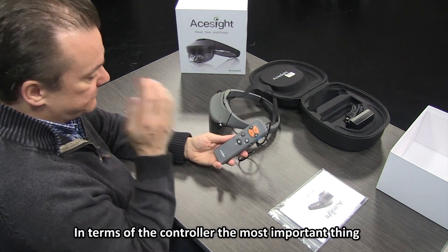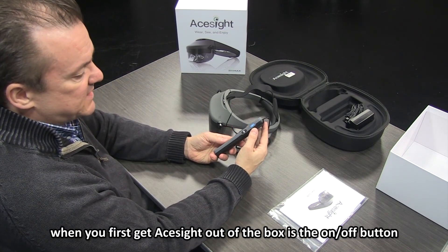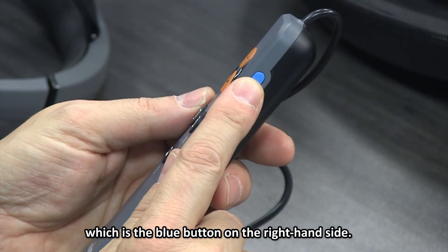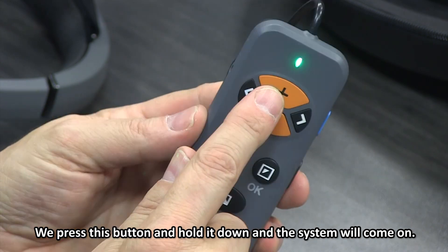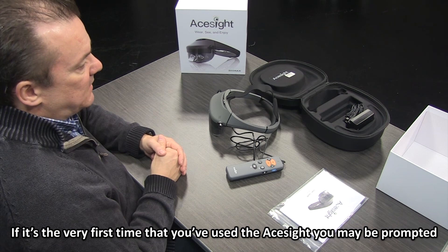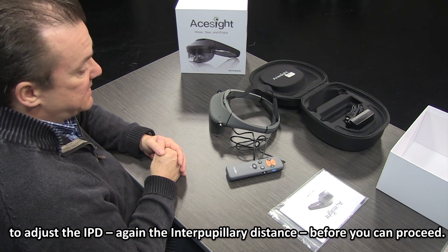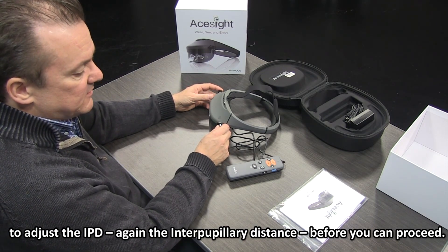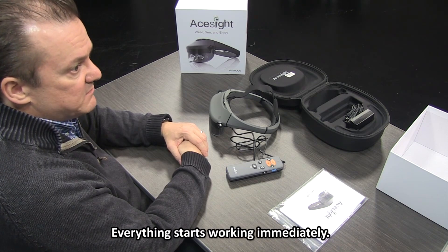In terms of the controller, the most important thing when you first get ACE Sight out of the box is the on/off button — the blue button on the right-hand side. Press and hold it down and the system will come on. If it's the very first time you've used ACE Sight, you may be prompted to adjust the IPD — the interpupillary distance — before you can proceed. But once you've done that, you're good to go. Everything starts working immediately.